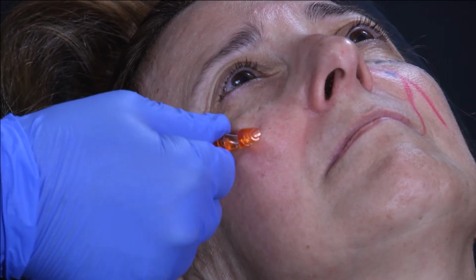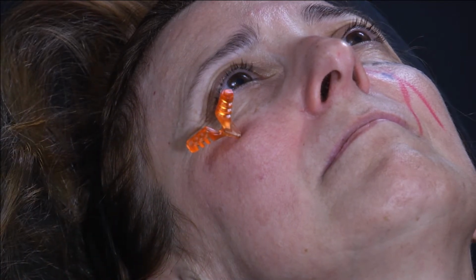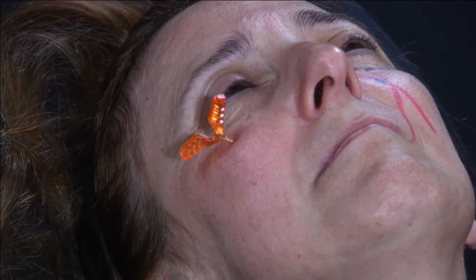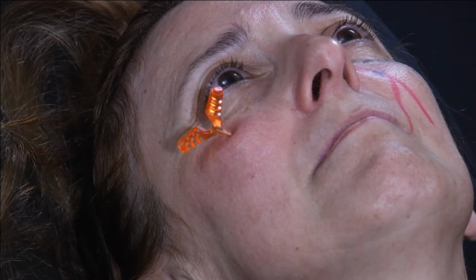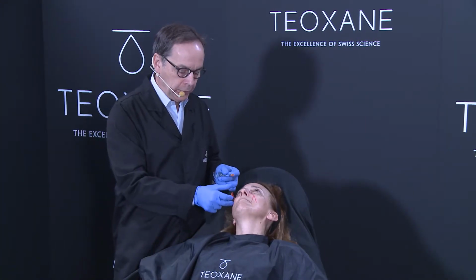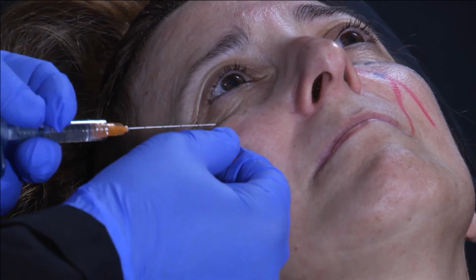I touch the bone, because like this, I know where I am, and I know where will be the tip of my cannula. If you don't do that, your cannula will need to reach the bone, cross all the tissue, and it will be very difficult for your patient, because she will feel pain.